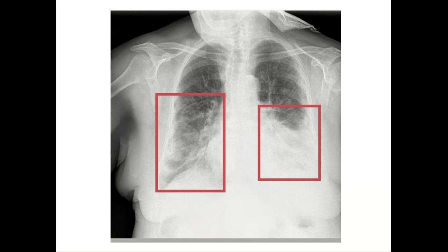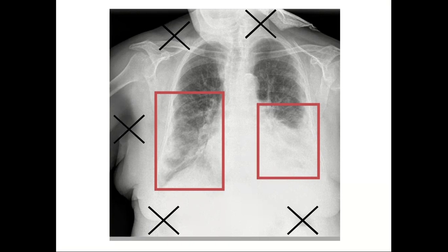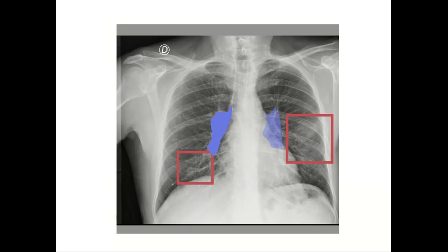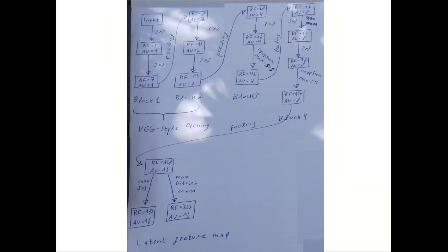Why can this be important? The most obvious example would be that we do not care for any opacity-like mark when it is located outside the lungs. Each and every one of those will be a false positive. Another example is that around the spine there is always something that looks somewhat similar to opacities, but is actually the very normal and healthy pulmonary artery. If we want the model to be able to identify these organs, we must, as a prerequisite, of course, supply it with a large enough receptive field to be able to do that.